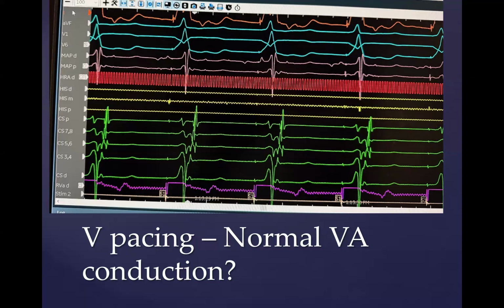So in some patients, you ablate the pathway and there's actually no ventricular atrial conduction. In those patients, you don't have to give adenosine after the ablation because you don't have any VA conduction at all. Now, some people would give it because the theory is that maybe you would fully block the node and you'd see the pathway. But the truth is if you have no VA conduction through the AV node, then that should maximally show you if there's any residual pathway left, right?